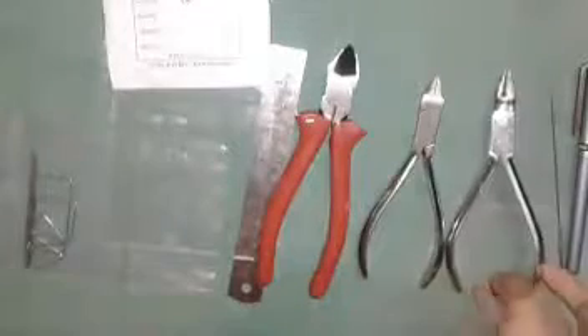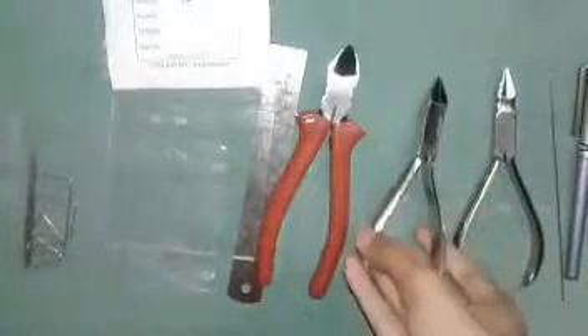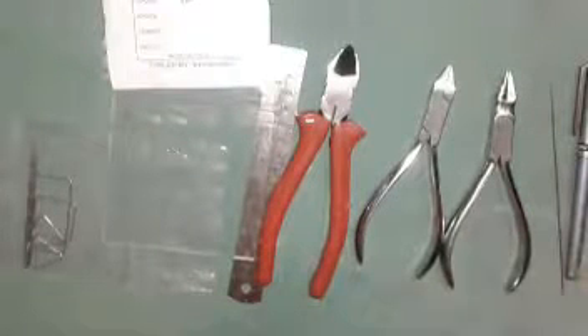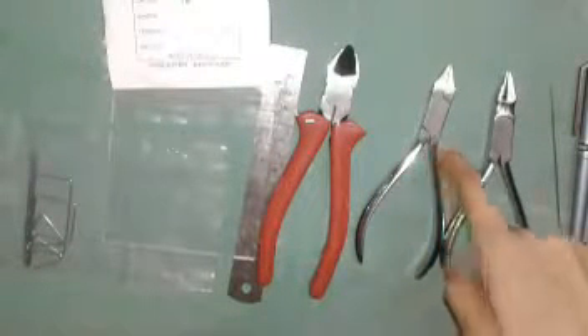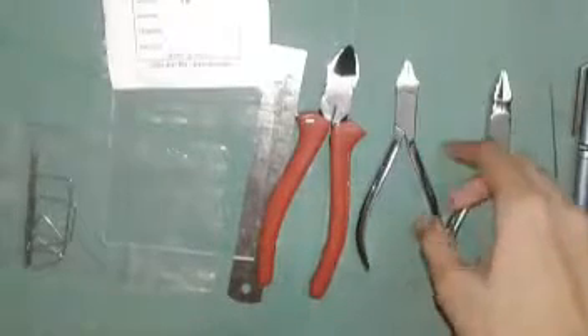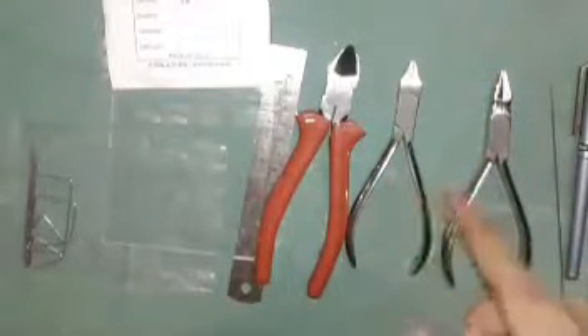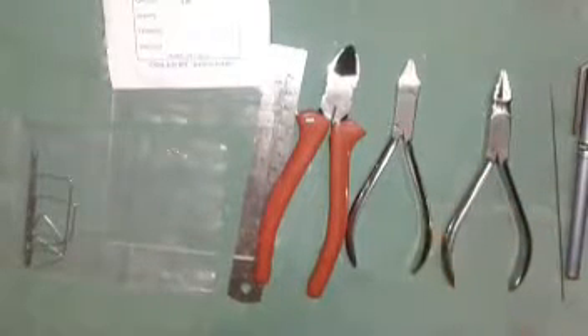This one is the universal plier, used primarily for wire bending. And this one is the Adams plier, used for the making of the Adams clasp — I will show that later. Always use these both pliers in the full stainless steel and metallic framework type.